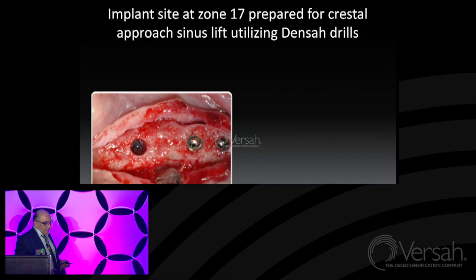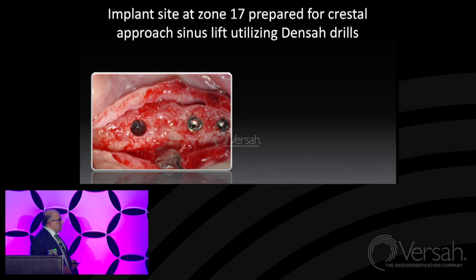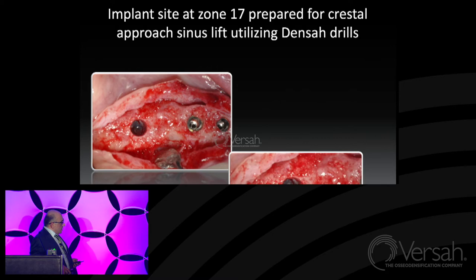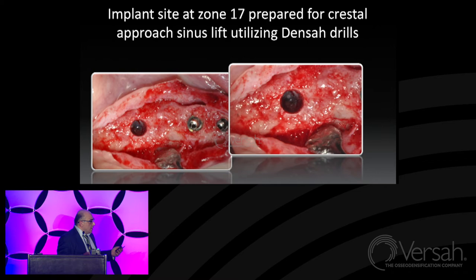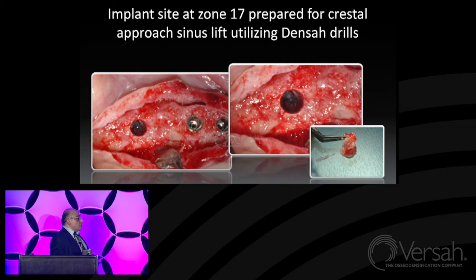Then we go to the zone of the second molar. Look at this picture. We make the sinus lift at this zone, and we will show you how it looks. Here it is. Look at this zone. We see the intact membrane of the sinus using the technique which Dr. Ziv Mazur presented yesterday in his lecture. And it works 100%. Sometimes it doesn't work because we are in a hurry. But if we follow the protocol, everything works well.